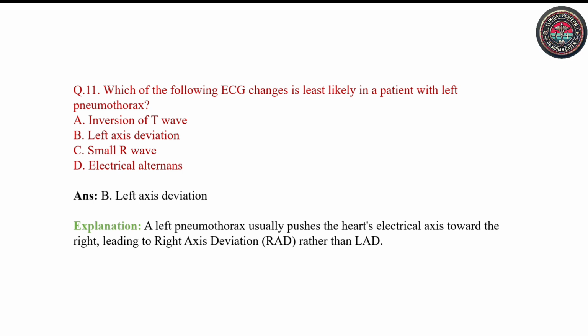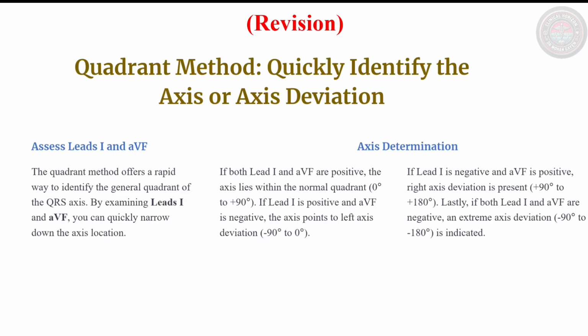Now that we have worked through the multiple-choice questions, I encourage you to take a moment to revisit the methods of axis determination. Having a strong understanding of these methods is essential before we proceed to real ECG-based axis determination cases.